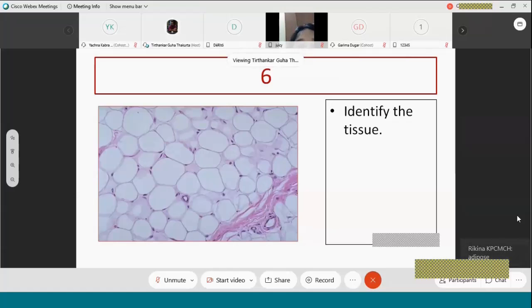You can also see a band of fibrous tissue running through this. And this small round structure below the fibrous band, what might it represent? Think of what cylindrical structure might pass through the adipose tissue. Wonderful. So this is some kind of a blood vessel. And the violet cells that are lining the inside of the blood vessel are the endothelial cells.